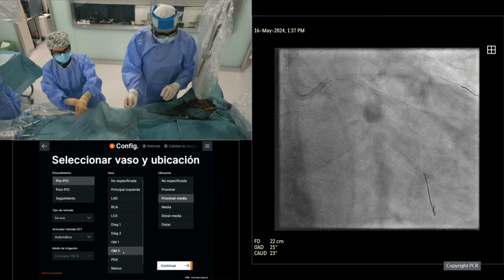So here we start in the distal edge of the stent. It looked like we landed in an appropriate place. There is no edge dissection. So number one, no edge dissection. Good news. No distal edge dissection. Okay. Number two, stent expansion. Yeah, exactly. So we're moving along the stent, and we will give you some numbers about the expansion. But to me, in a general initial view, just a qualitative assessment, it looks quite okay.